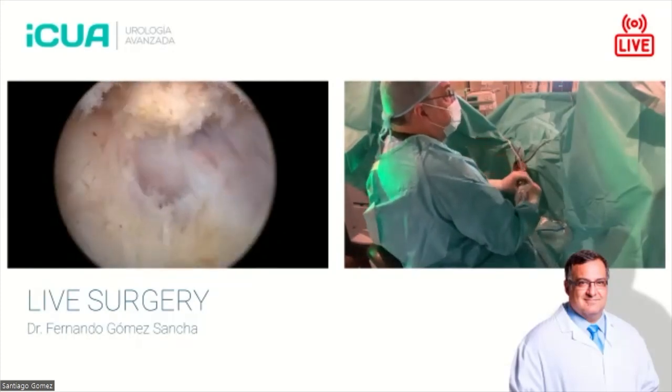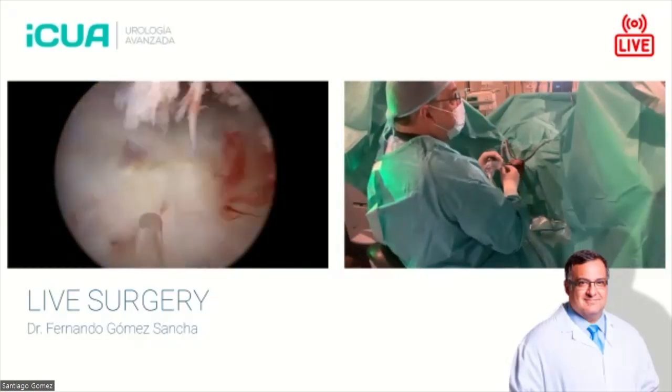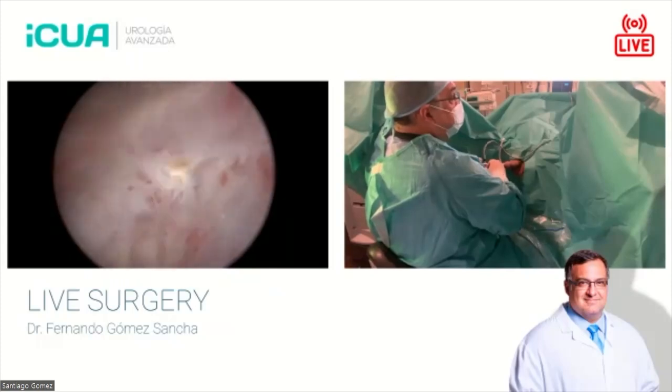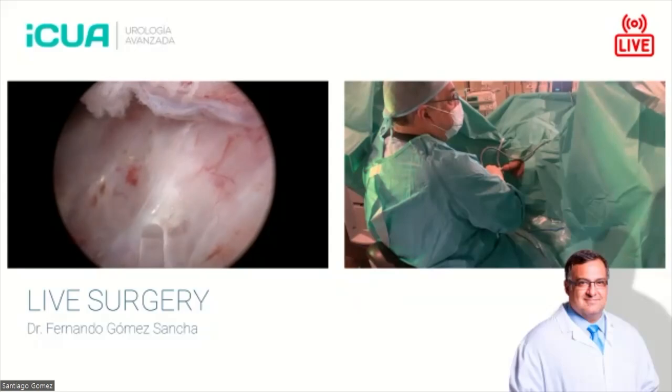You have to start distinguishing the capsule because there are fibers, you see, in the surface. Also the color. I would say the adenoma is quite more yellow and the capsule is more white. So with these factors in mind, we can progress in our operation.